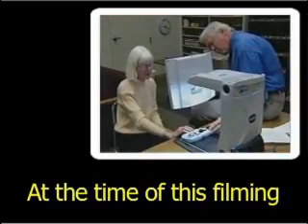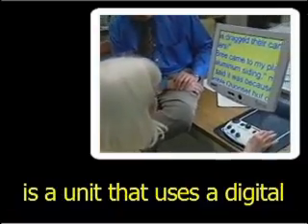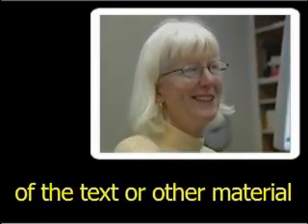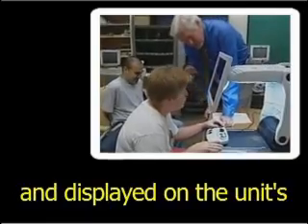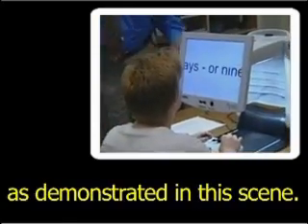At the time of this filming, the most recent development in video magnification systems is a unit that uses a digital camera to take a picture of the text or other material placed under the camera. The image is then enlarged and displayed on the unit's flat panel LCD monitor, as demonstrated in this scene.